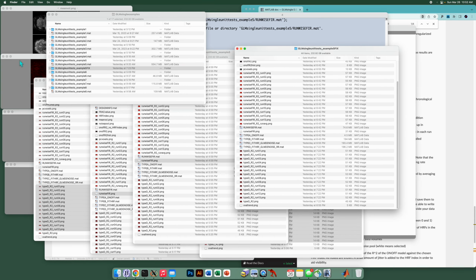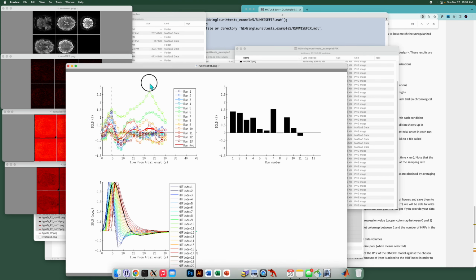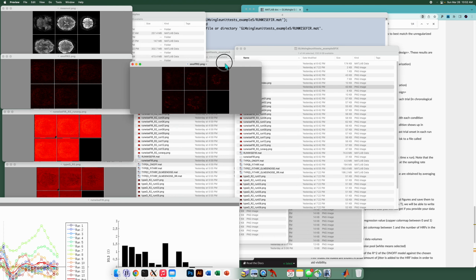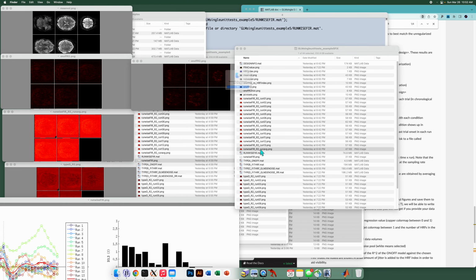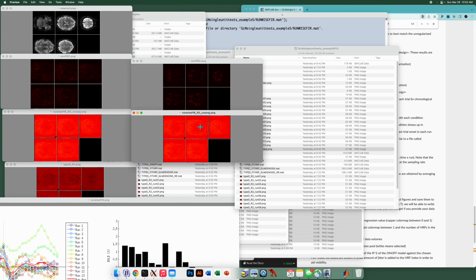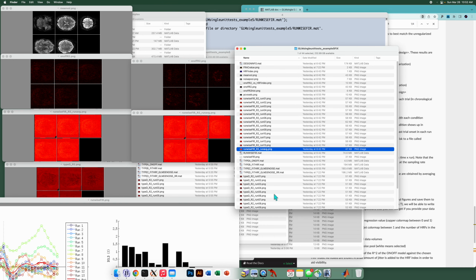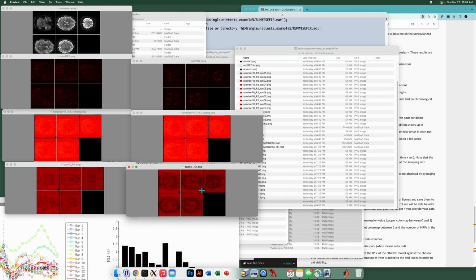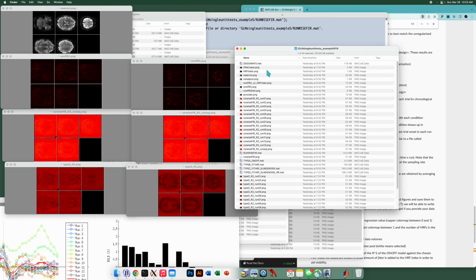So in the fix case, let's move some of these windows aside. We can pull up some comparisons. So that's on-off R squared. This actually should look the same. Remember, this is a diagnostic model that makes no assumptions about the HRF, and it's the same. And then we're going to look at type D R squared just for a visual comparison. So clearly something helped, right? We get these nice punctate regions. By the way, this experiment is expected to only drive very little bits of cortex, so this also fits other expectations. So in some sense, we've rescued this data set.